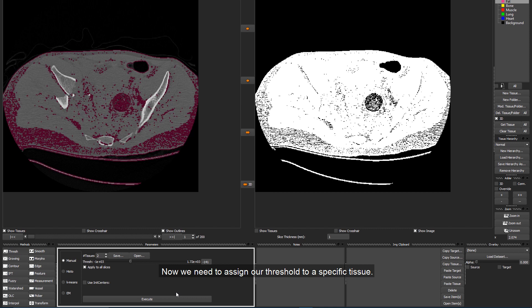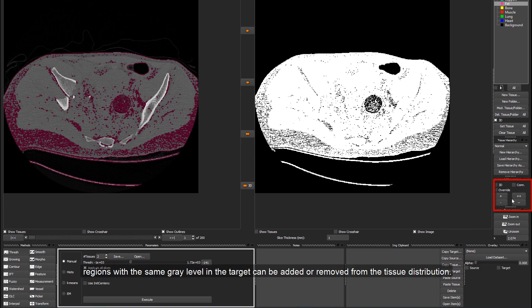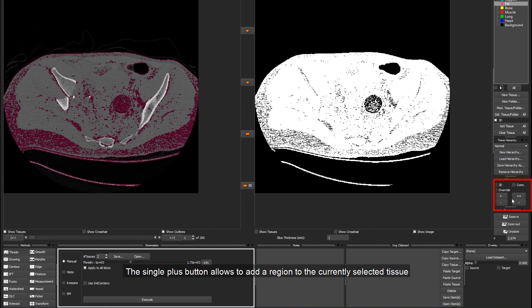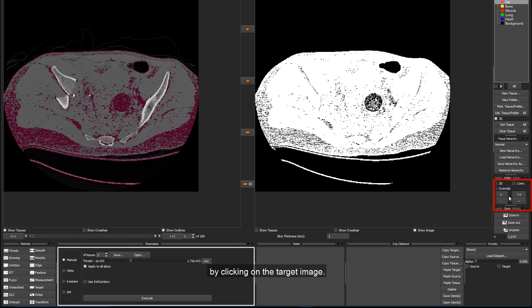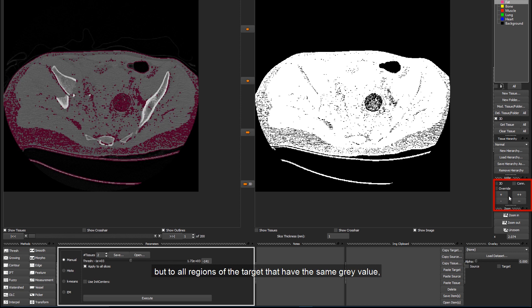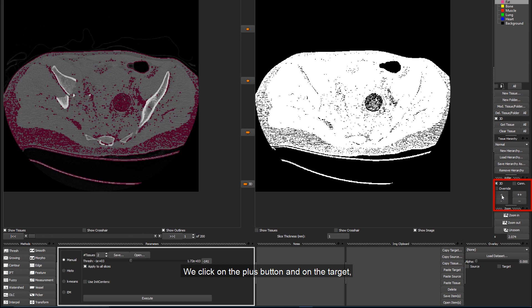Now, we need to assign our threshold to a specific tissue. In this case, the tissue called Fat. To do this, we use the Adder function. With the Adder buttons, regions with the same grey level in the target can be added or removed from the tissue distribution. The single plus button allows to add a region to the currently selected tissue by clicking on the target image. And to apply this operation not only to the currently displayed slice, but to all regions of the target that have the same grey value, we also enable the 3D option here. We click on the plus button and on the target and we can see that now everything is assigned to Fat.